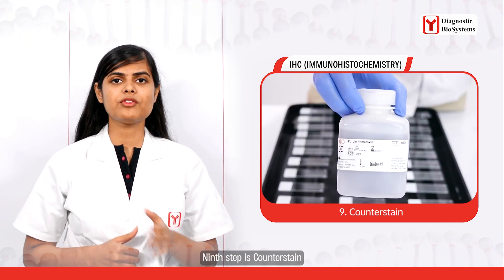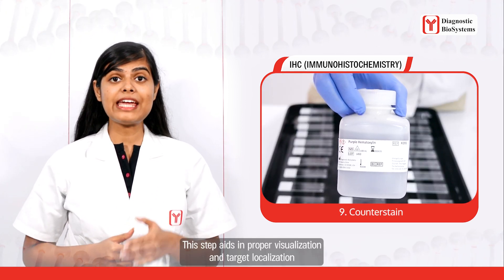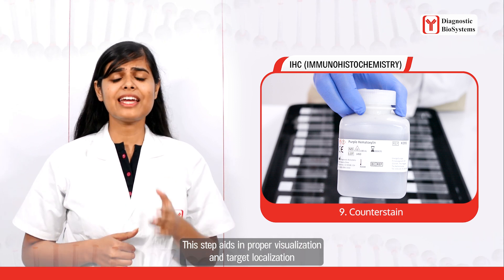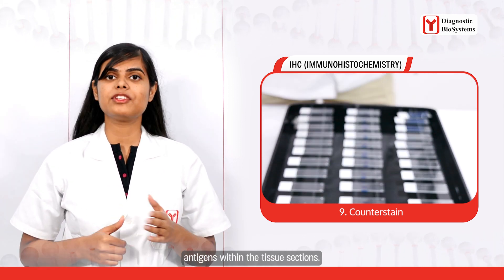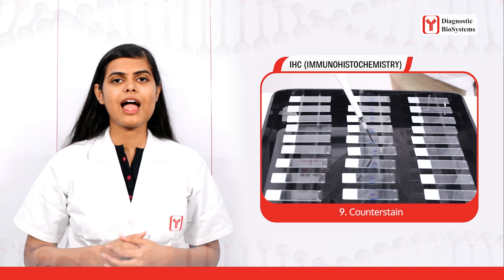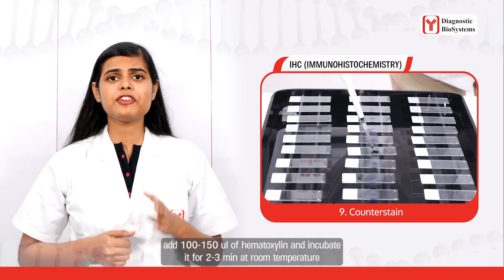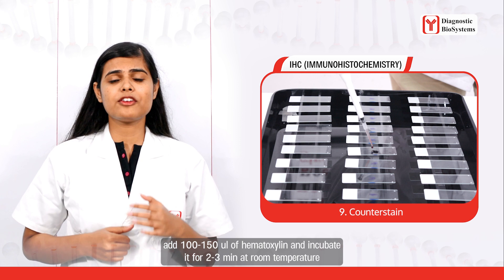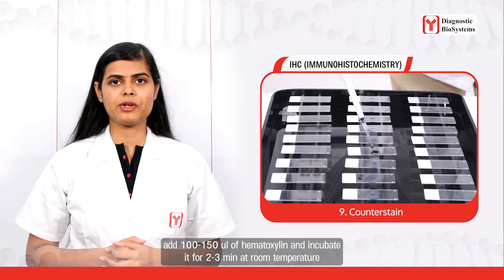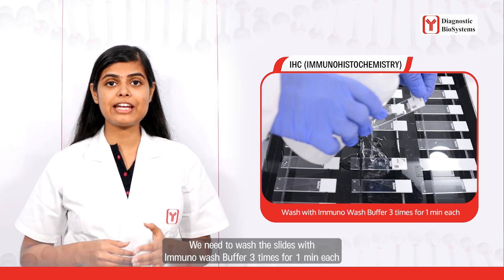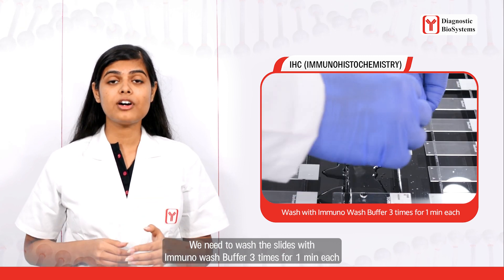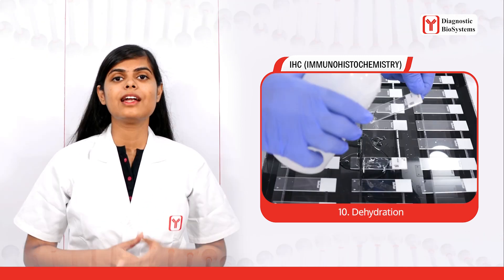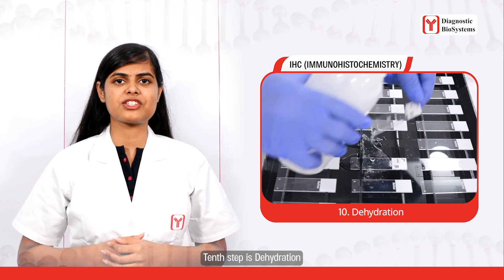The ninth step is counterstaining. This step aids in proper visualization and target localization of antigens within the tissue sections. Add 100 to 150 microliters of hematoxylin and incubate for two to three minutes at room temperature, then wash the slides with immunowash buffer three times, one minute each.